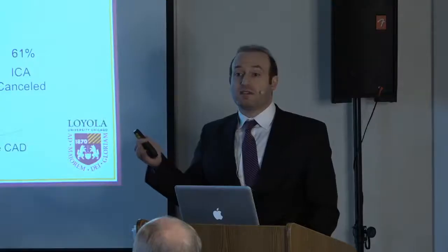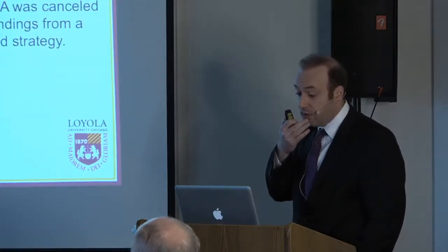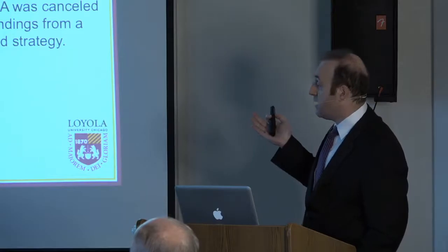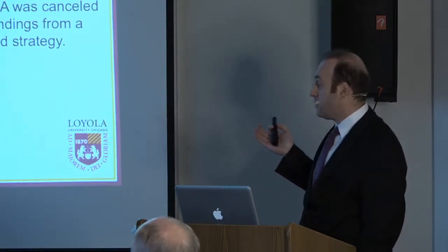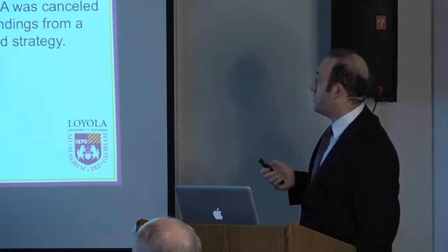We're not cathing 61% of the patients that we would have otherwise done with usual care. And the answer to that question is yes. There was proven safety and durability, durable results through 1 year, and this is data presented by Pam Douglas out of Duke University at the American College of Cardiology in 2016.